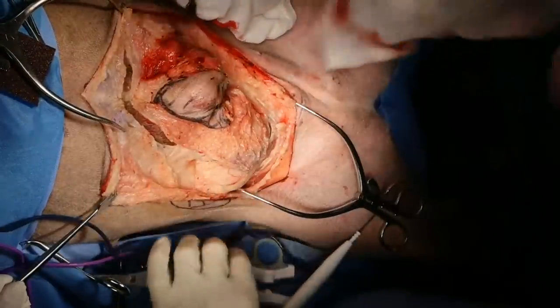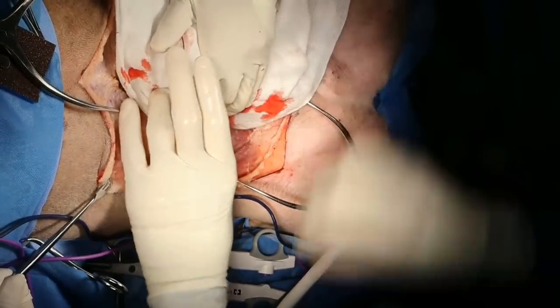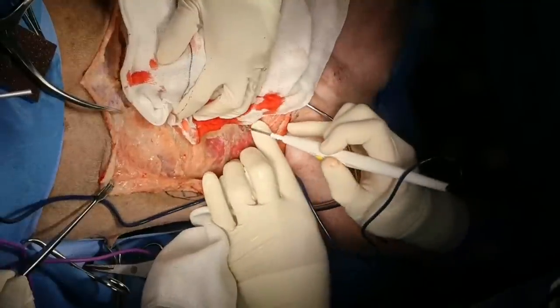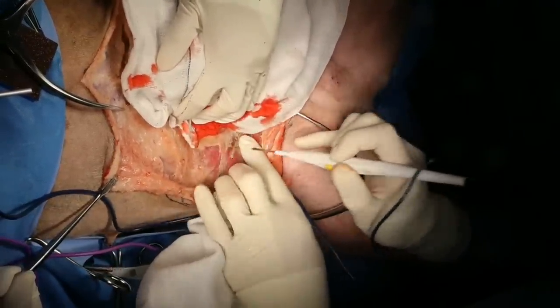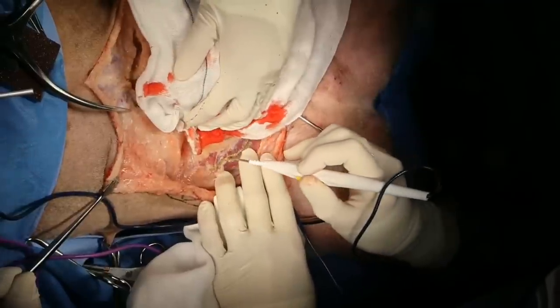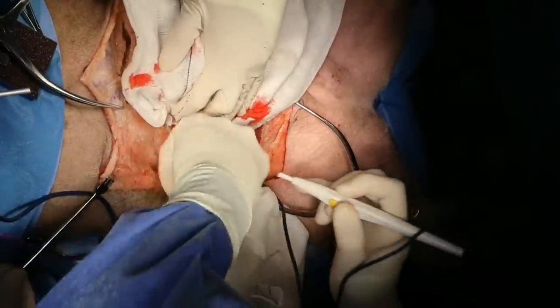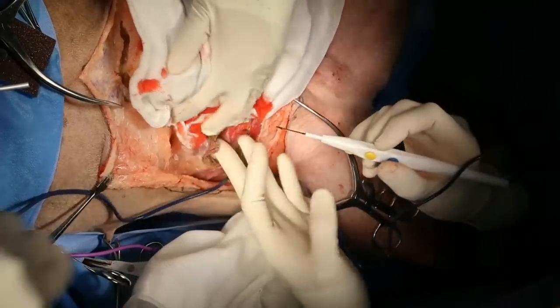So Mel, what I'm going to have you do is grab onto the tumor there. Grab. So I'm going 2 centimeters in the muscle belly itself, and I'm only taking skin margin where the skin's adherent to the tumor where the biopsy was. All right, so now we're to internal abdominal oblique.